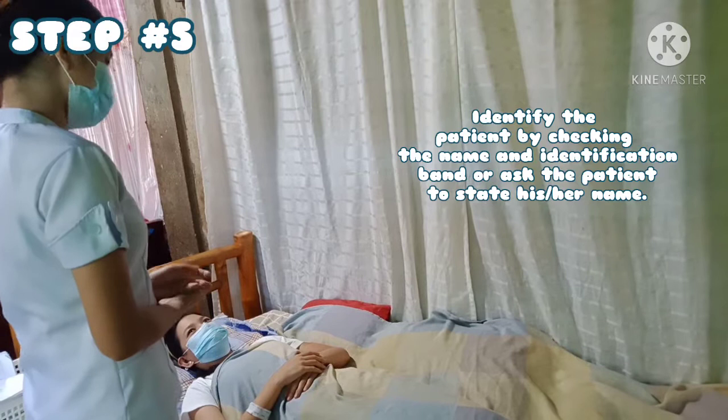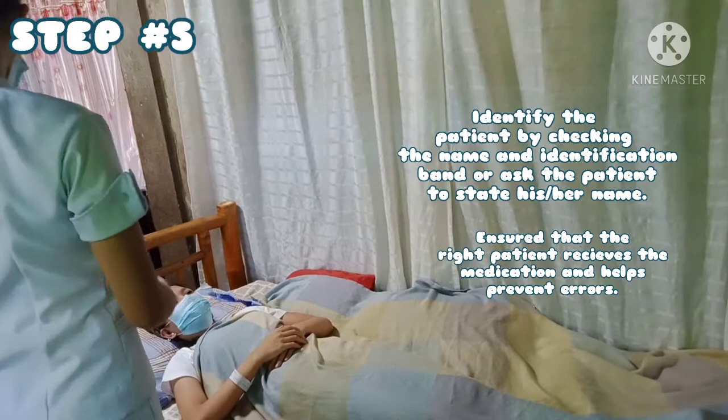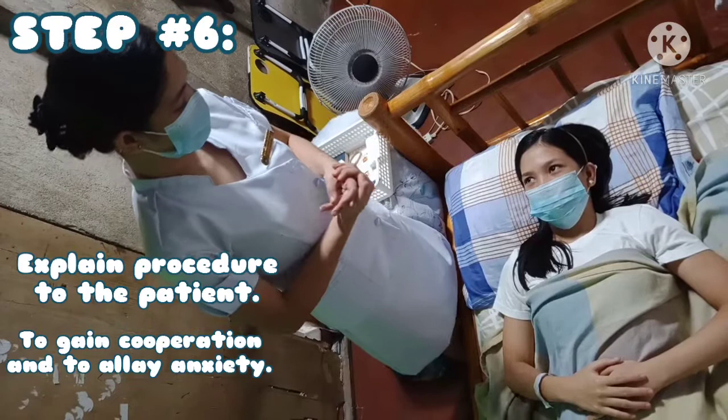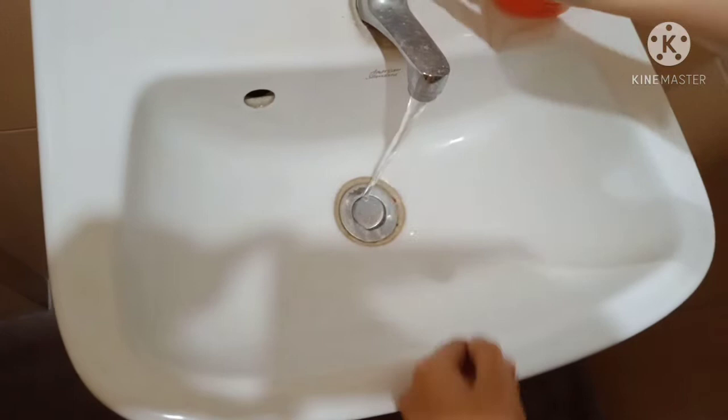Step number five: identify the patient by checking the name or identification band, or ask the patient to state his or her name. This ensures that the patient receives the right medication and helps prevent errors. Step number six: explain the procedure to the patient. This helps to gain cooperation and allay anxiety.